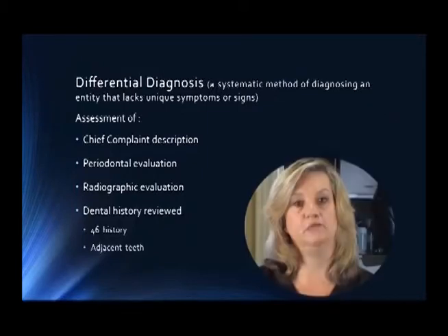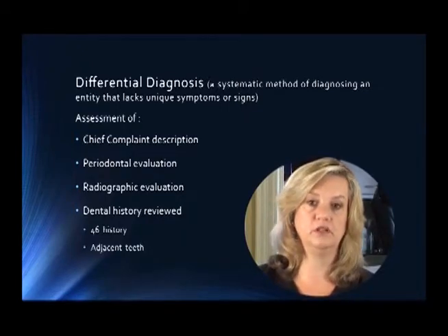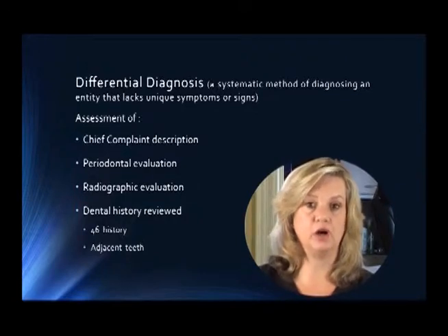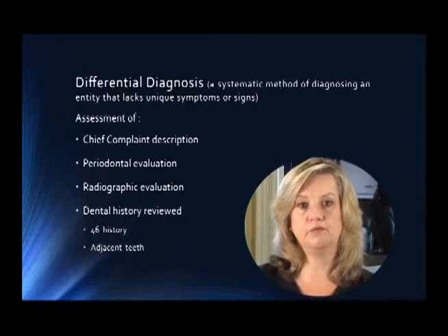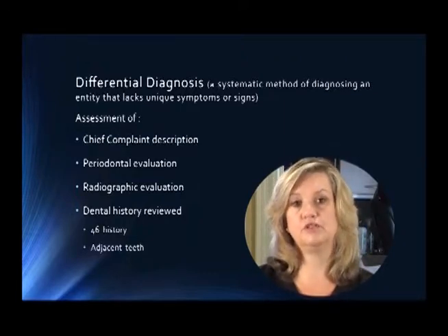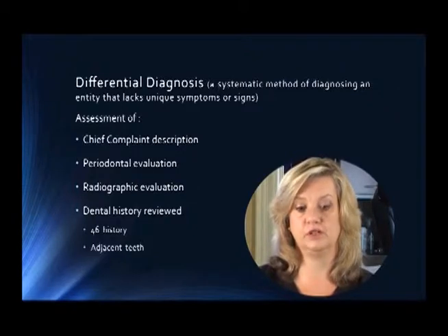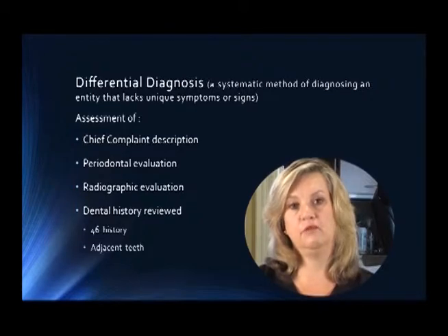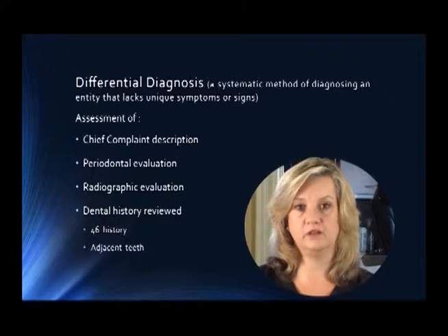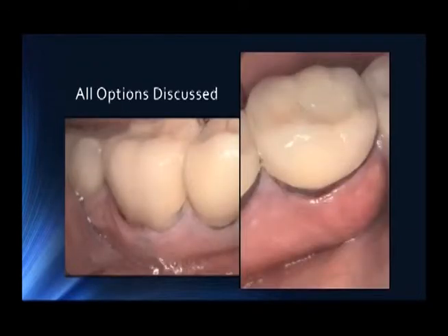Then we had to do a periodontal evaluation, which did encompass definitely pocketing on the lingual aspect. It had pocketing before, so we weren't quite sure if we were dealing with a cracked root or a further endodontic situation or a periodontal situation. We reviewed the dental history of this tooth. We also looked at the review of the adjacent teeth so that we could see what encompassed our concern in that area.